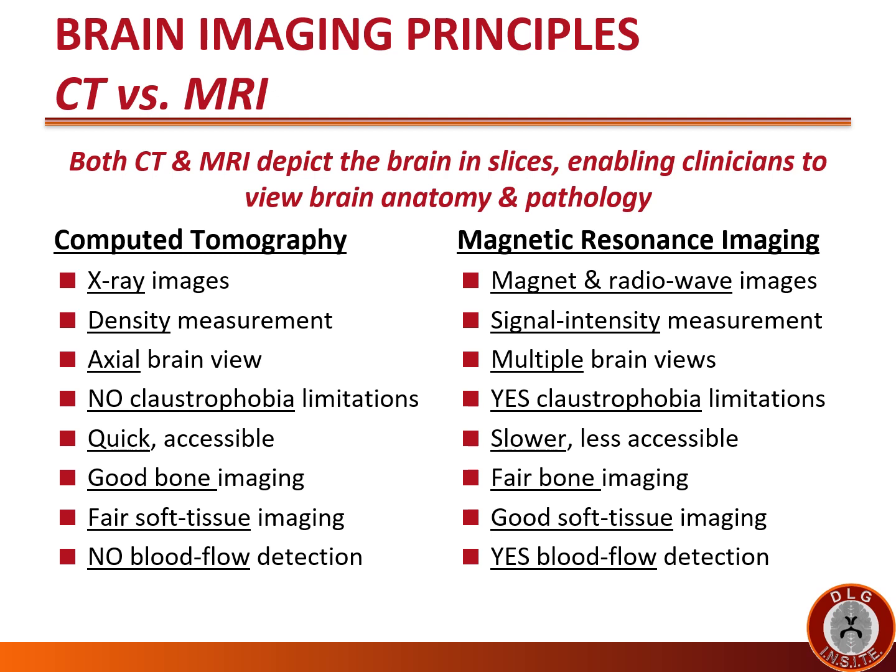Likewise, CT does not portray blood flow at all. There's no blood flow detection, whereas MRI is good for blood flow detection.